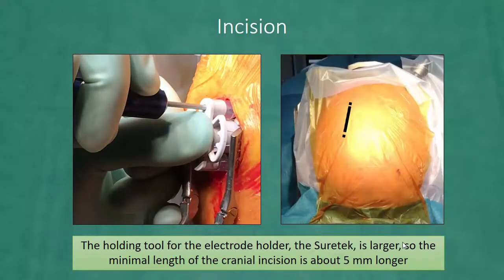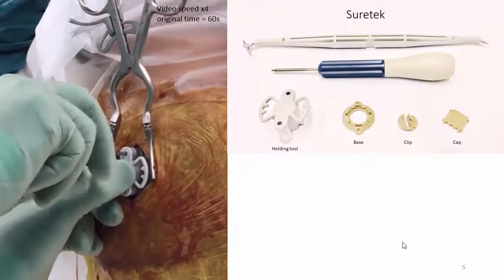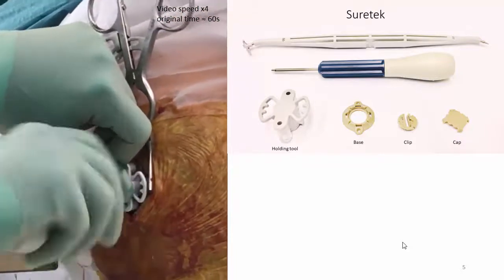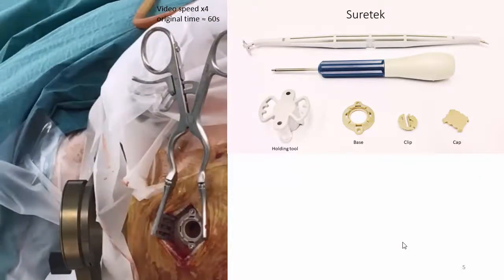The first thing is that the holding tool for the electrode anchor, the SureTek, is larger, so the minimal length of the cranial incision is about 5 mm longer. The anchoring device for the electrode, the SureTek, is similar to the Stimlock from Medtronic and is mounted in the same way. The base is placed in the burr hole using the holding tool and attached with two screws as seen here.